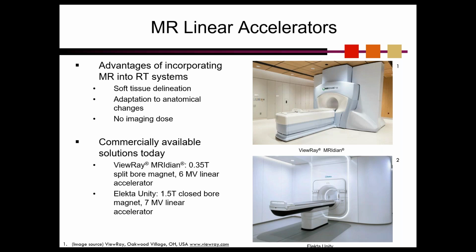At the University of Wisconsin-Madison, we presently use ViewRay and have been since it originally went live with Cobalt-60 back in 2014. The advantages of using an MR-guided linac are most apparent when treating, for example, challenging abdominal cases where the positions of patients' bowels may change frequently and must be accounted for prior to each fraction.